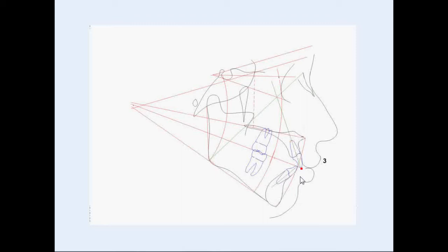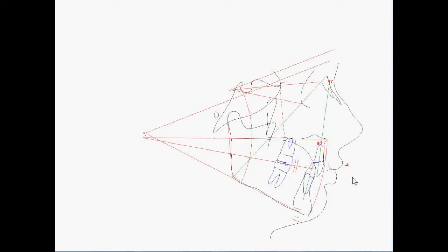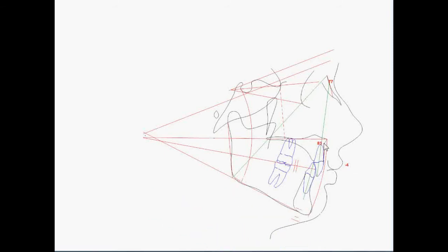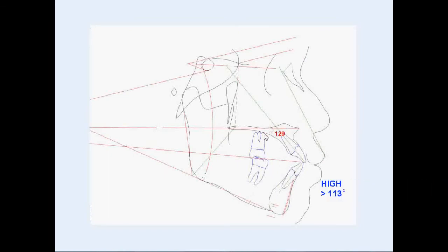In addition to the position of the upper incisor, Sasuni Plus also identifies the angle of the upper incisor. You will need to measure the angle from the long axis of the upper incisor to the palatal plane. 110 to 113 degrees is normal. Anything greater than 113 degrees, the angle is high, and anything less than 110 degrees, the angle is low. In this case, the angle is 83 degrees, so it's low. This angle helps to determine the length of the front end of the maxilla. When it's low like this case, a sagittal can be used to develop the premaxilla forward and flare the anteriors forward, which will lengthen the maxilla and move ANS closer to the anterior arc where it should be.